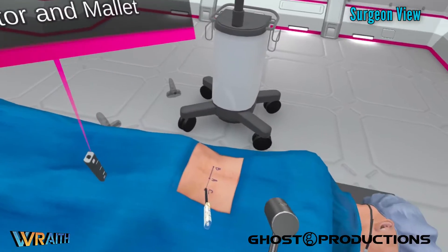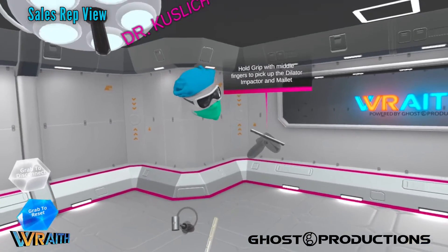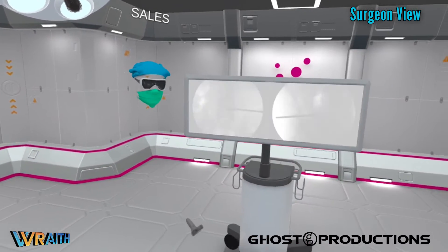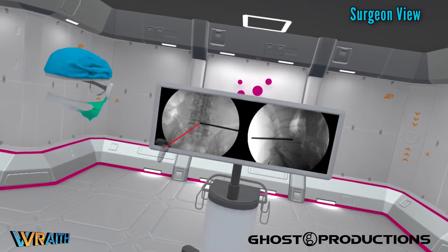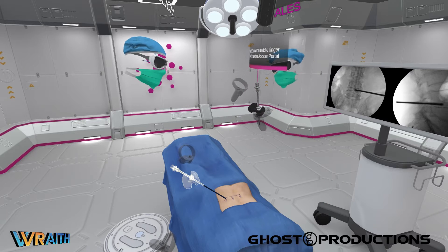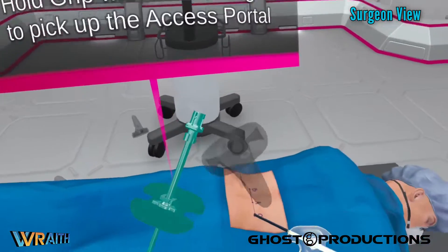The white end of this impactor moves the neural probe deeper, and the blue end moves the dilator deeper because it has a larger hole. Give it three taps with that. You can see the blue dilator is now over the top of the neural probe at about the midline of the disc. This is our access portal — it gets put over the top of the dilator and engages the end plates and the annulus about three or four millimeters into the disc space. This is set at 38 millimeters currently. That's correct — that's the default setting.